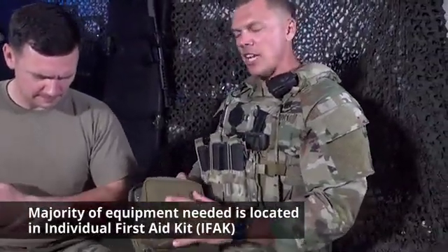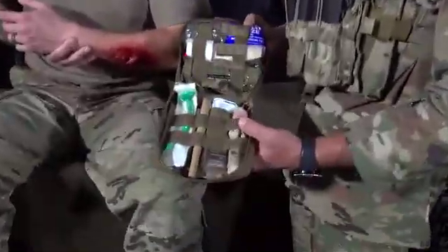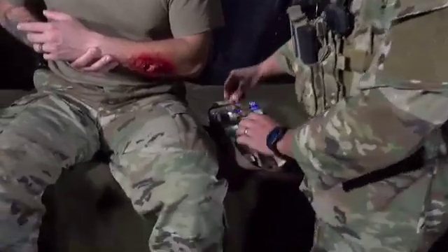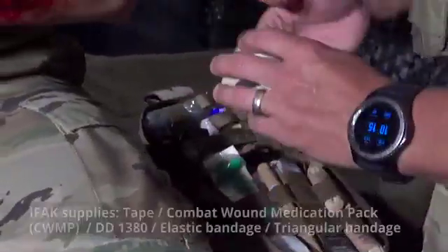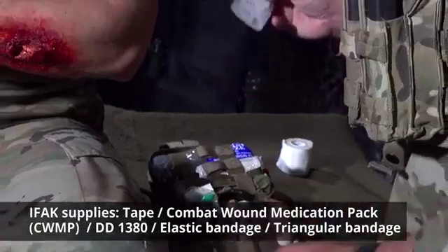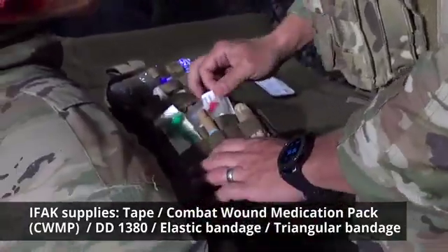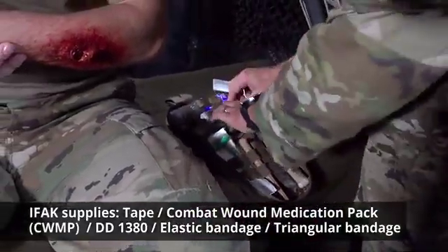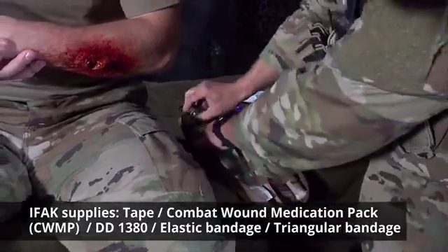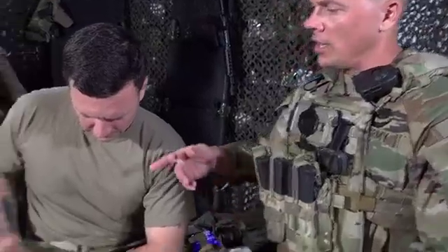The vast majority of equipment needed to perform this procedure is going to be in the casualty's IFAK. I'm going to open it up and get out a few supplies: my roll of tape, the combat pill pack, our DD 1380 — we'll need that — and this elastic bandage as well as our triangular bandages.